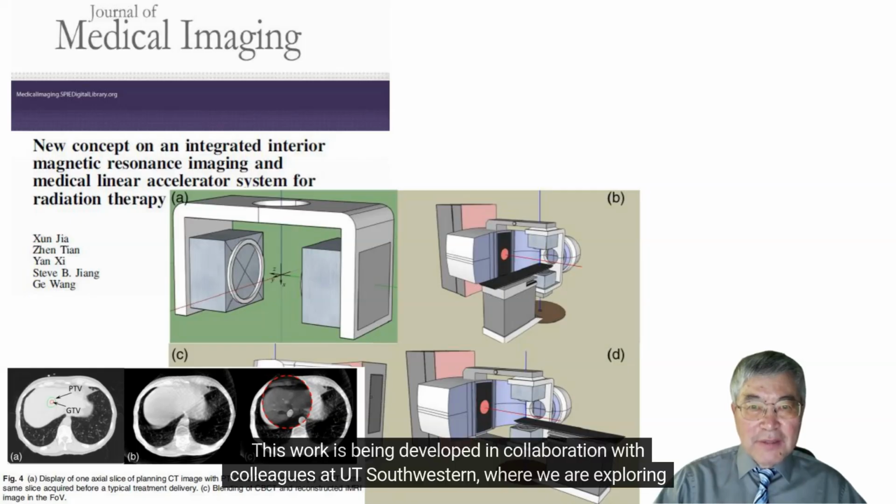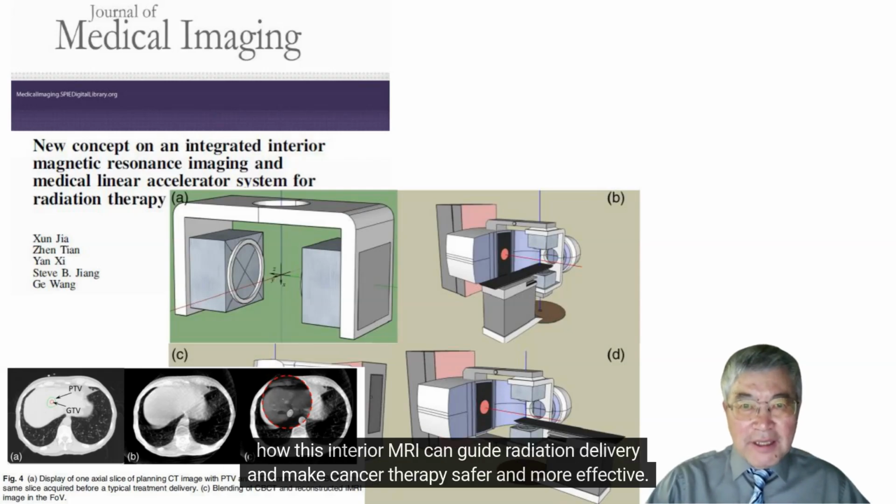This work is being developed in collaboration with colleagues at UT Southwestern, where we are exploring how this interior MRI can guide radiation delivery and make cancer therapy safer and more effective.